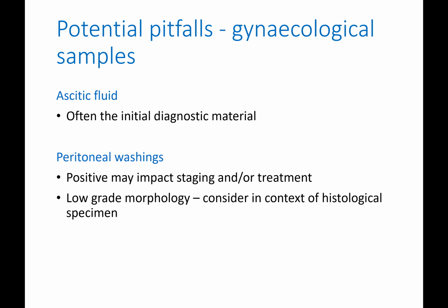Gynecological samples are common and important. With ascitic fluid, it's often the initial diagnostic material, and with peritoneal washings, a positive washing may impact on staging and/or treatment. We have to bear in mind that low-grade morphology has to be considered, however, in the context of the histological specimen, and that can sometimes be a pitfall.